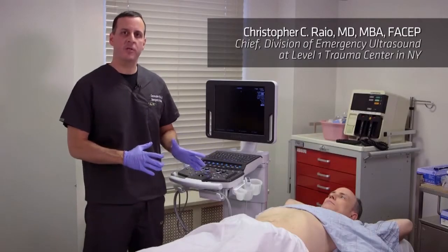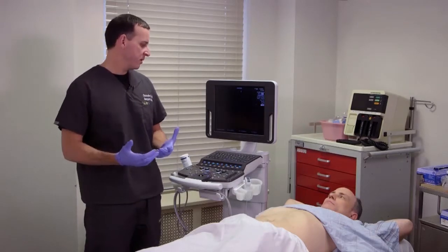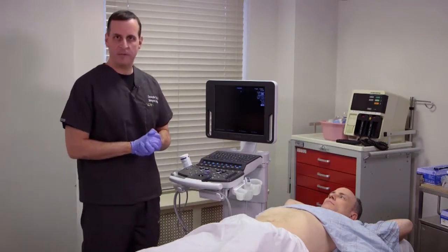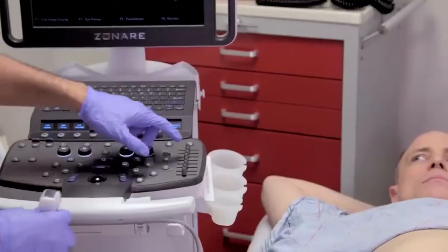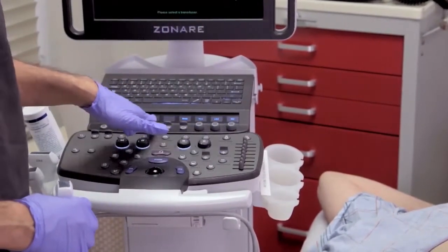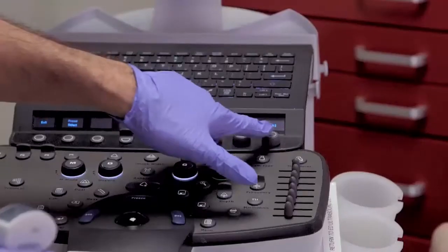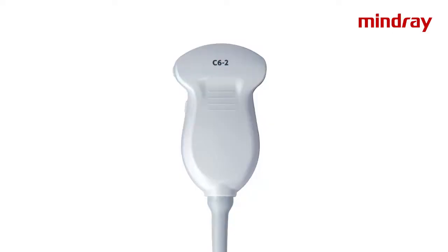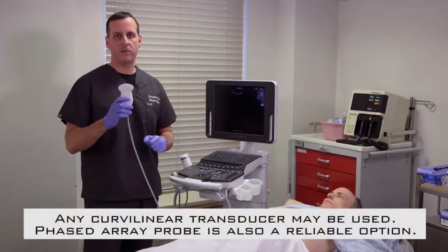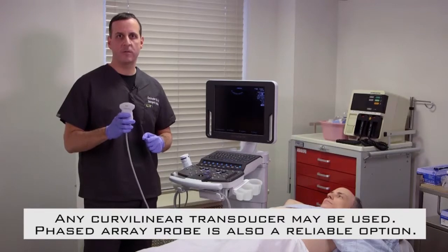Once we have our patient information entered into the system or electronically through your CPOE order entry system, the next step is to determine which transducer you're going to use and then adjust for the proper presets. The Z1 Pro makes this very simple. For this portion of the exam, we're going to cover the abdominal portion below the diaphragm. We're going to choose our curvilinear probe, the C6-2. This is a lower frequency probe that gives great penetration to image obese patients and intra-abdominal organs really well.